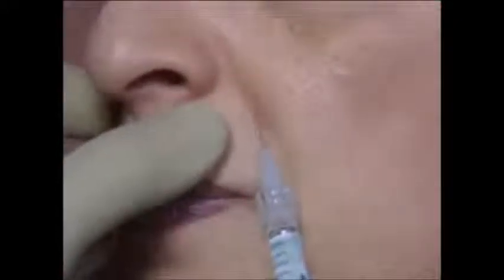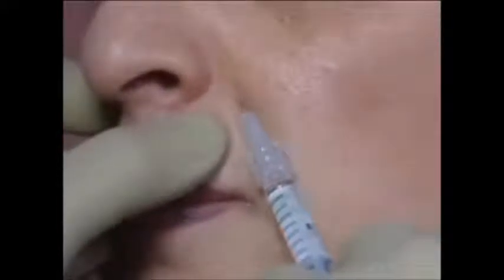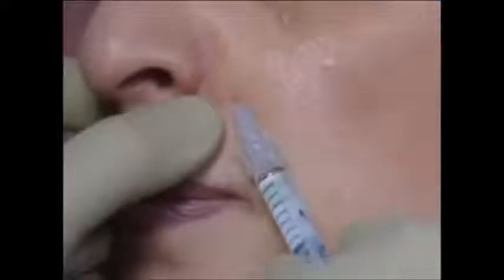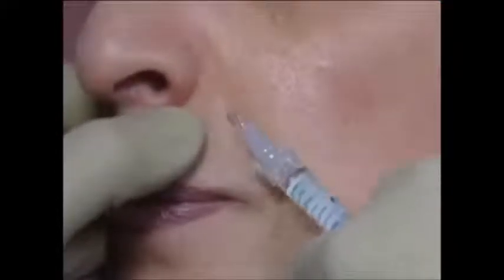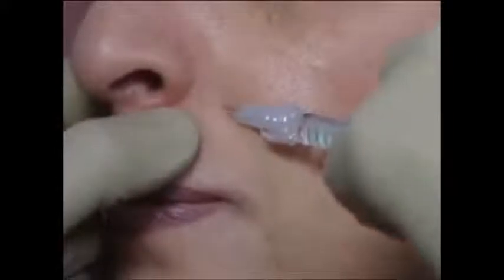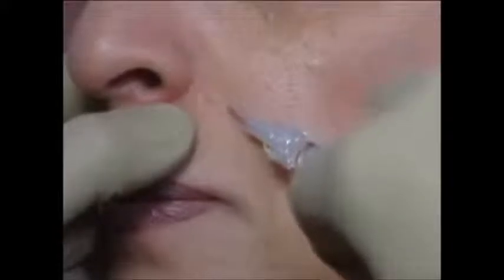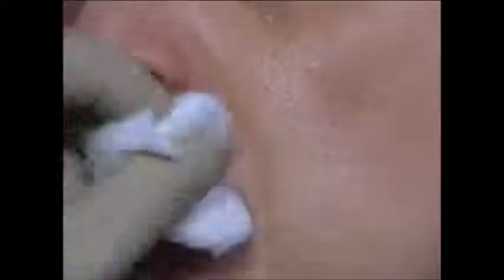On the left side, the nasolabial fold is slightly deeper, and at the alar base, an additional injection will be performed with slightly greater volume than on the right. It is important to pay attention to these asymmetries. Again, the syringe is pushed under gentle pressure so that the fluid or gel slowly tracks into its natural subcutaneous positions. Massage helps to smooth out any slight irregularities.